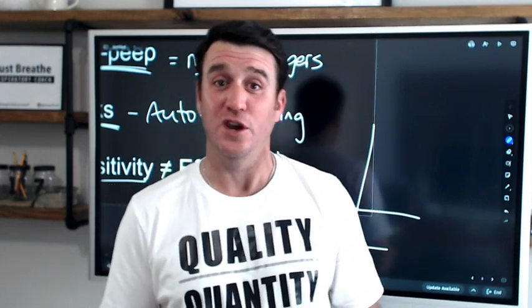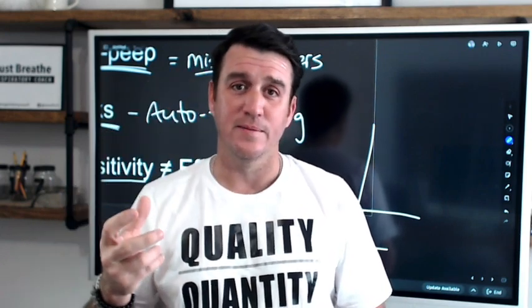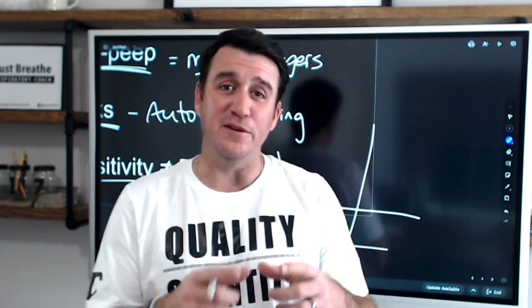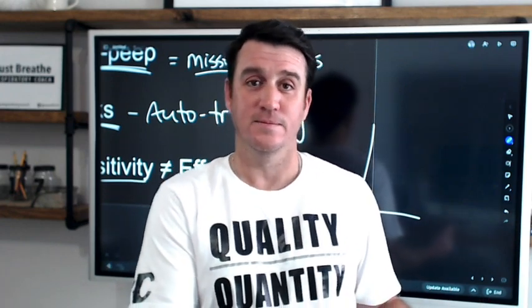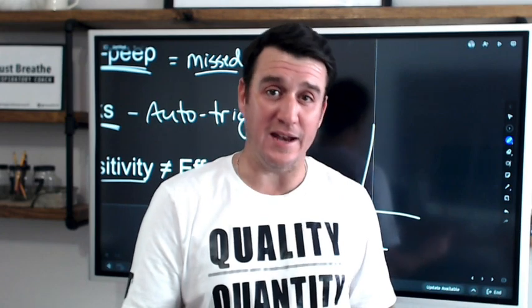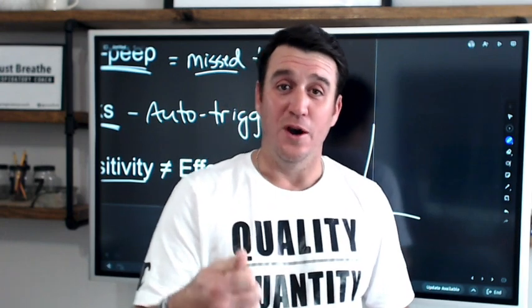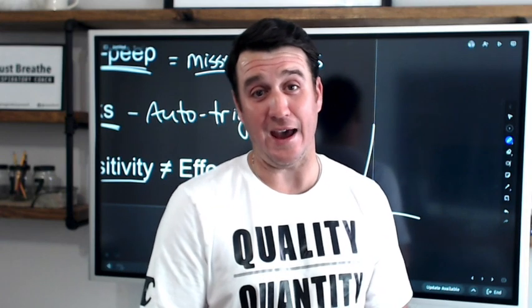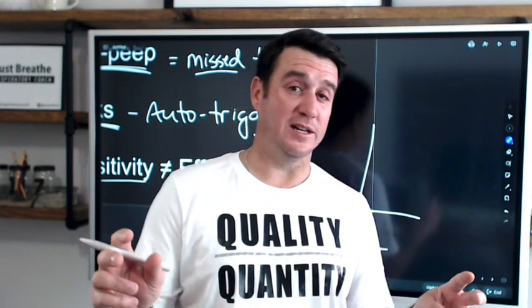Maybe our mechanical ventilation settings are not correct, and their occlusion pressure and work of breathing and neural drive is very, very distressed. You have to figure out what is going on with that patient and understand that making the ventilator not respond to a patient who is actively trying to take a breath, well, let's just say that does not sound very humane to me. And so for the sake of humanity, let's find ways to treat that patient better. Let's find ways to figure out why they are initiating so many breaths and maybe solve that instead of just locking them out of being able to initiate a breath. That's my 2 cents on that issue.